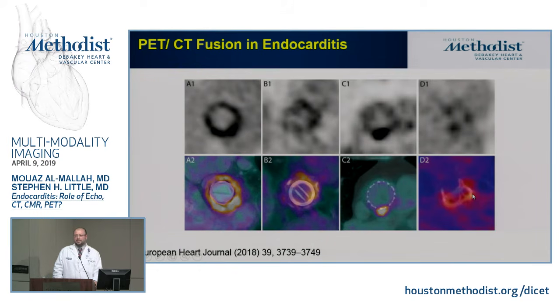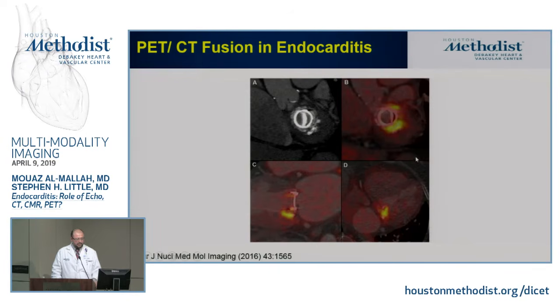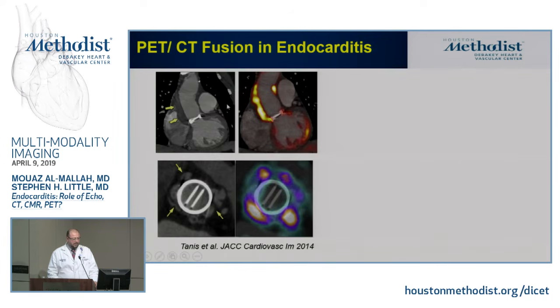It's very important to identify which ones are endocarditis and try to correlate it with the anatomy, to find out what exactly is going on at that structure. So if there is an abscess, for example, and dehiscence and collection by echo at that spot and it's lighting up, then this is highly suggestive of endocarditis in this patient. And if you have someone who clearly by CT has a collection there, with multiple areas of pseudoaneurysm or abscess-like collections, and now they are lighting up, then you are sure that these patients have endocarditis.